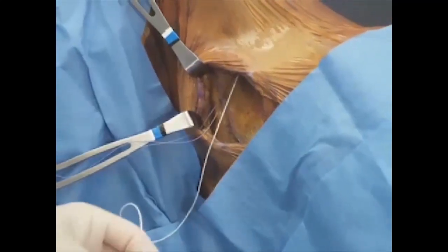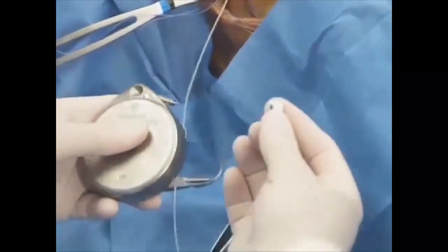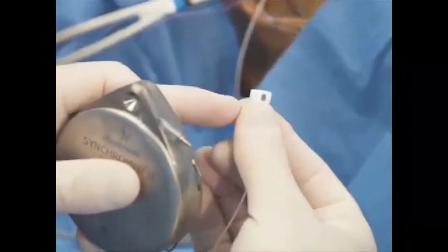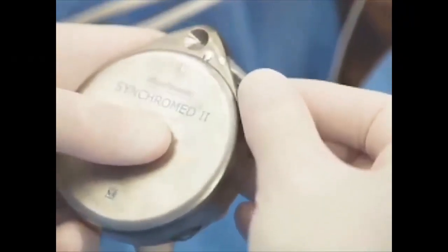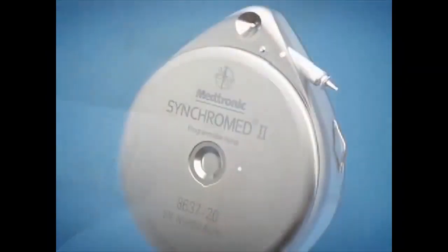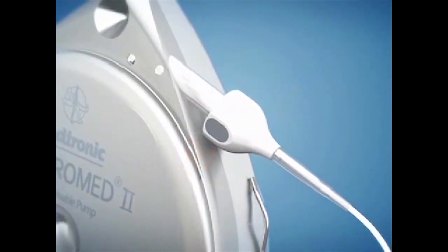To connect the catheter to the pump, grasp the tapered portion of the sutureless pump connector with your thumb and forefinger. Position the catheter port in line with the opening of the sutureless pump connector and attach the connector using one of the following methods. Firmly press the sutureless pump connector onto the catheter port until the connector fully covers the catheter port and the connector snaps into place. Or, firmly squeeze on the oval marks of the connector and carefully press the pump connector onto the catheter port until the connector fully covers the catheter port and snaps into place.